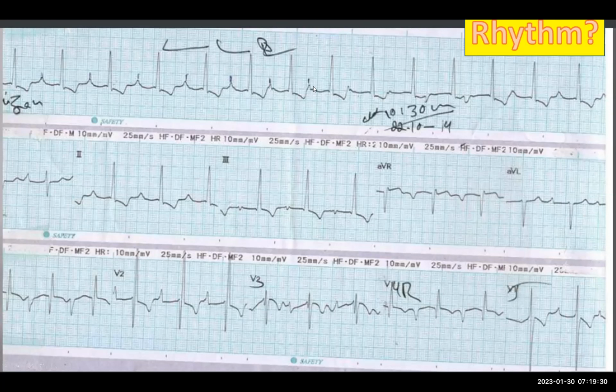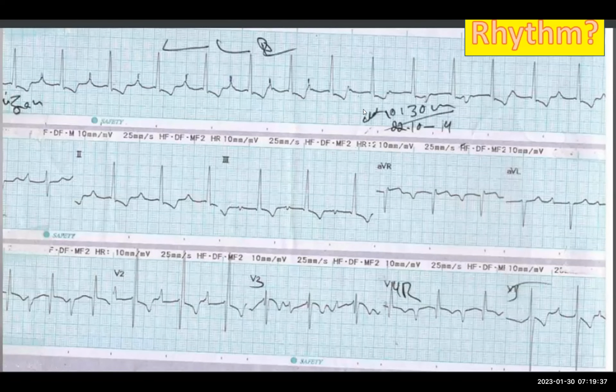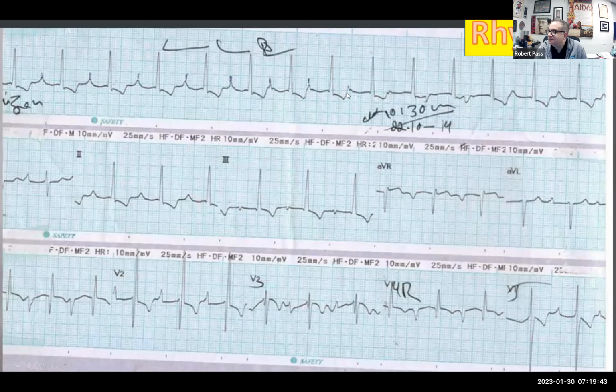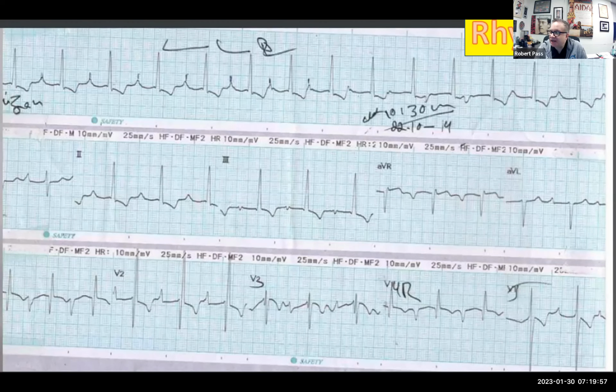I think the middle, it looks like it's lengthening, like that last one, but the last one that's dashed is a little bit longer than the ones prior to. And then you're almost seeing it where it's changing on that next, but where your mouse is, you're not seeing it quite as clearly, where you're almost losing it in the T wave. I think that second statement is more accurate. Yeah, losing it in the T wave.